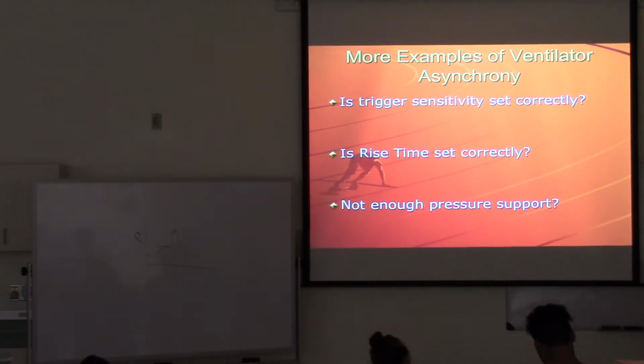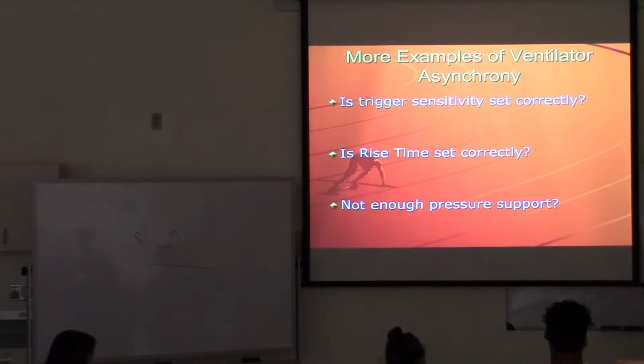Patients that have prosthetic heart valves, when the valves close or open, it causes a change in the flow going into the lungs, and it can actually initiate breaths. You'll notice that the patient's respiratory rate and the heart rate are the same. So in that case, you would have to go from flow-by into a pressure sensitivity setting to prevent all the auto-triggering.